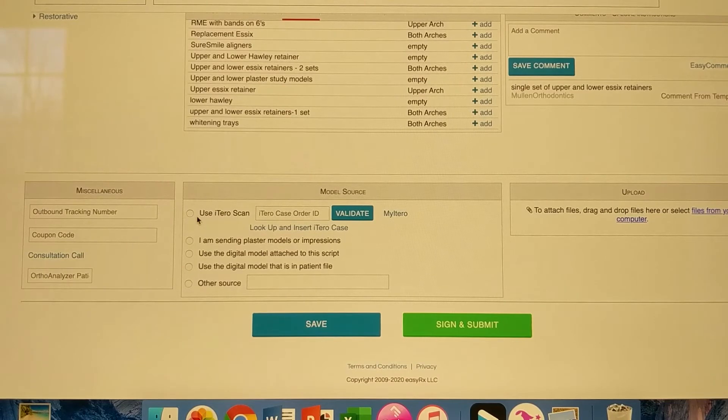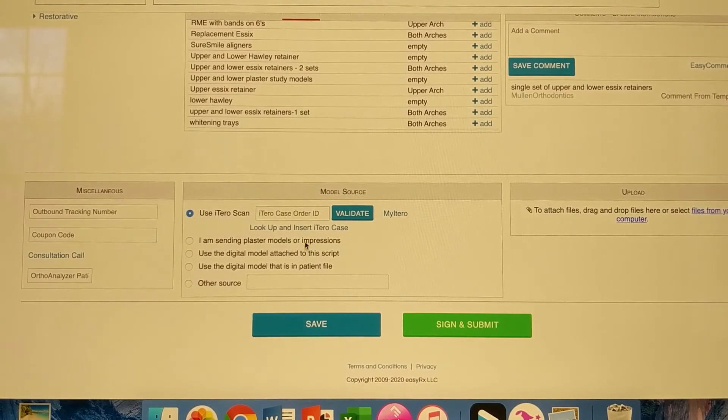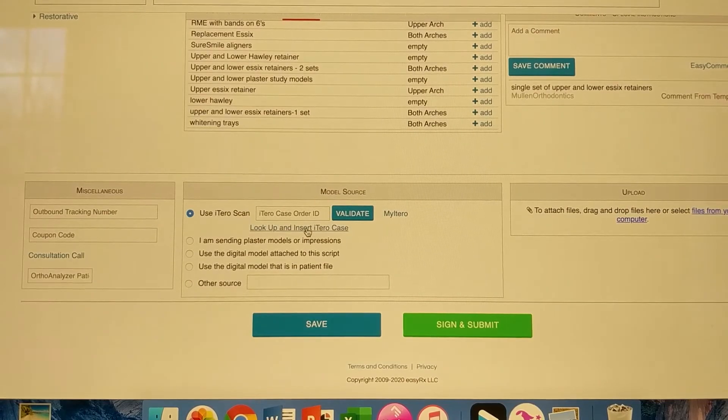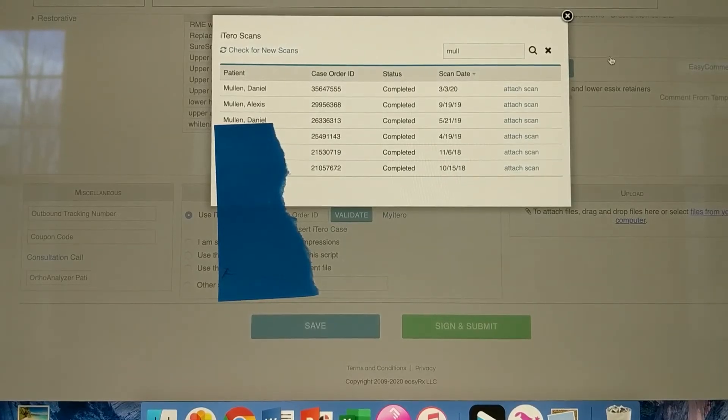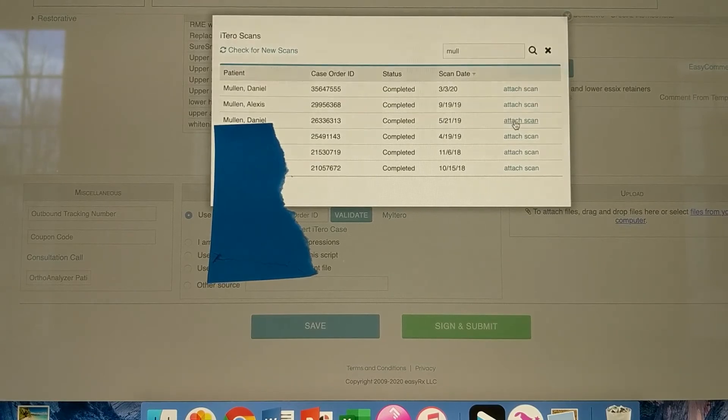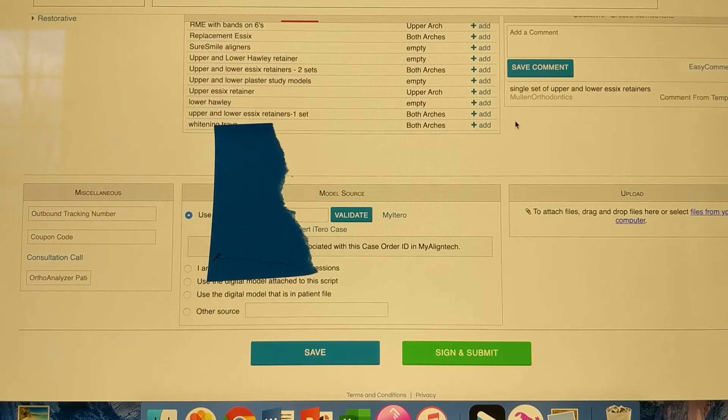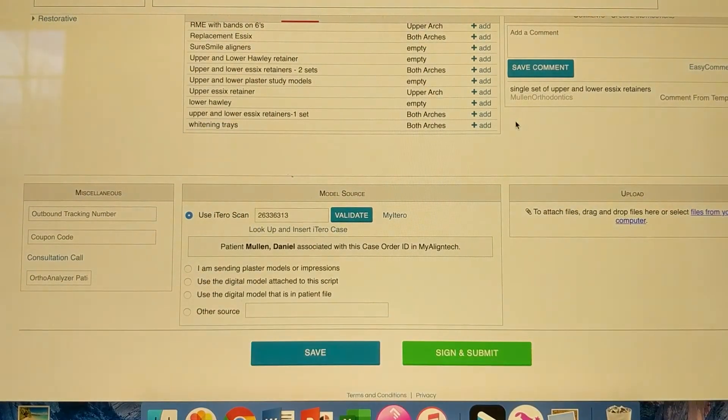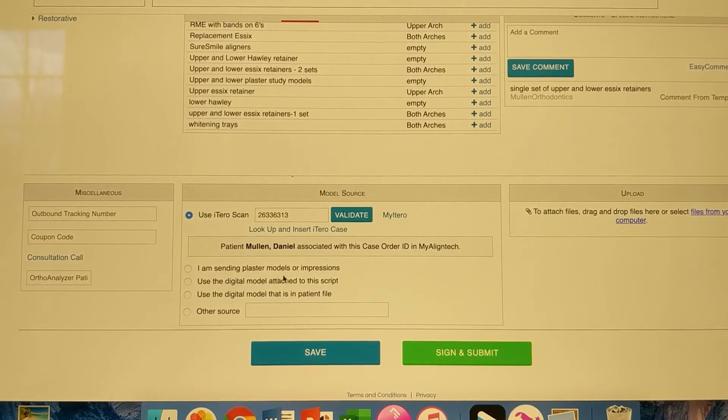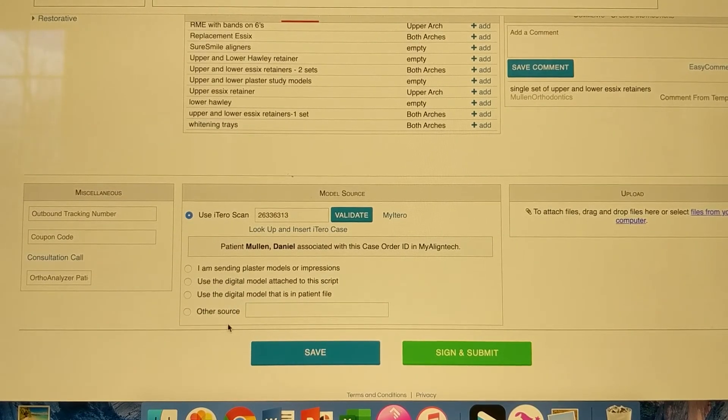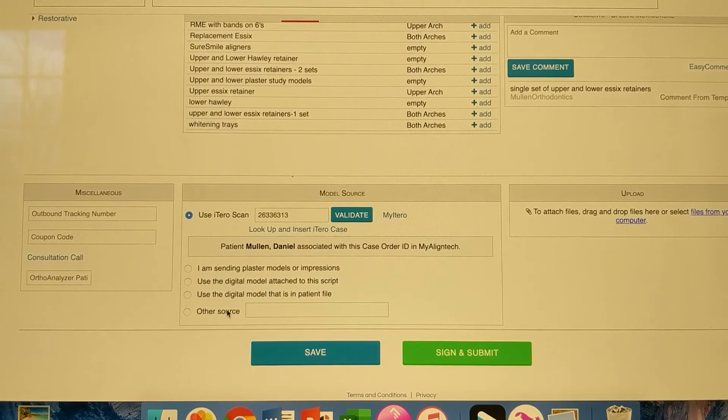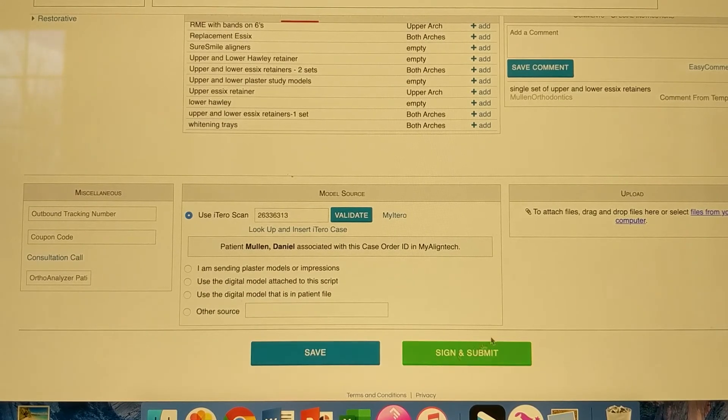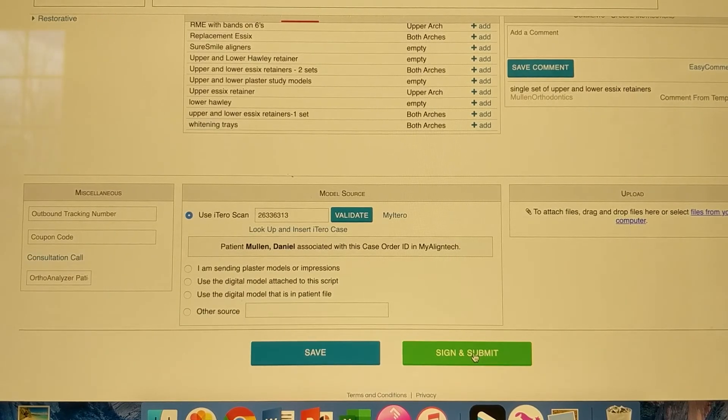So I use an iTero scanner in my office. So use iTero scan. Look up and insert. Let's do this. So I clicked on attach scan there. So that should attach it. Patient Daniel Mullen. The other options here, we don't use those very often. We usually use iTero scans. So then we are going to use this. Or excuse me, this green button. Sign and submit. So I'm going to click that.